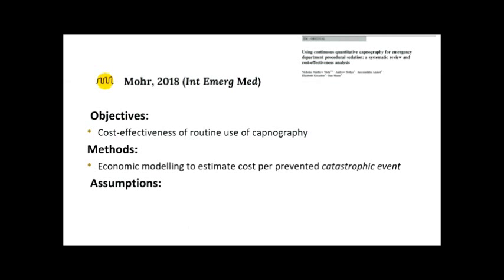They searched all of the emergency medicine literature: the RCTs, observational trials, and case reports. And they were not able to find a single catastrophic event. So no hypoxic brain injury and no death. They then expanded their search to the anesthesia literature, inpatient and outpatient. So we're talking endoscopy suites and dental procedures. They said that considering we can't find anything in the emerge literature, surely it's not going to be any higher than what we can find in the plethora of anesthesia literature.